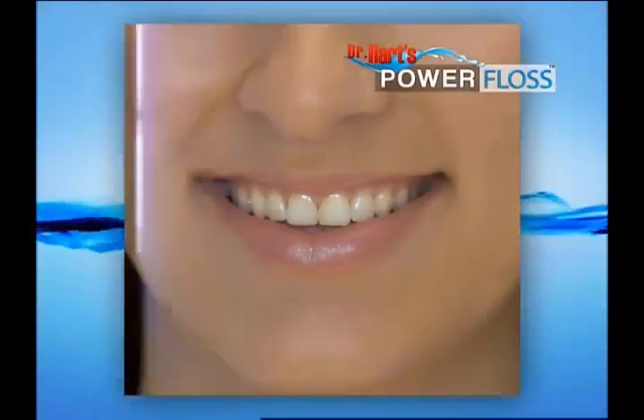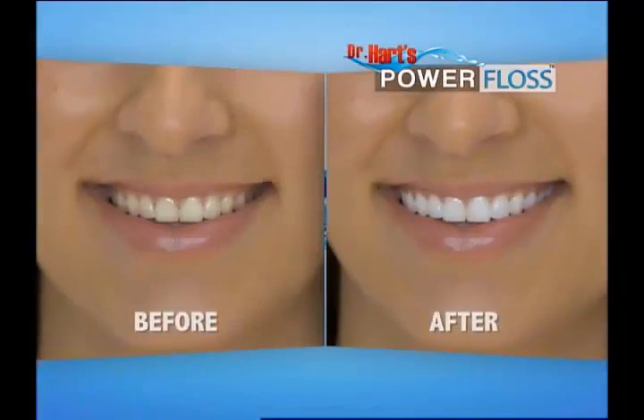Power Floss patients definitely are seeing results. The irrigation is happening. Long-term result is healthy gums, healthy teeth, and healthy mouth.